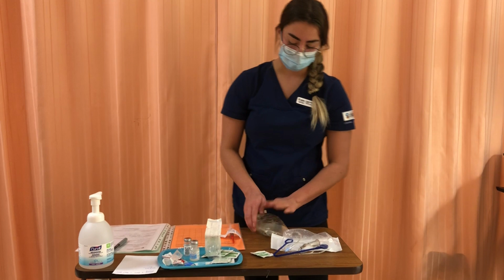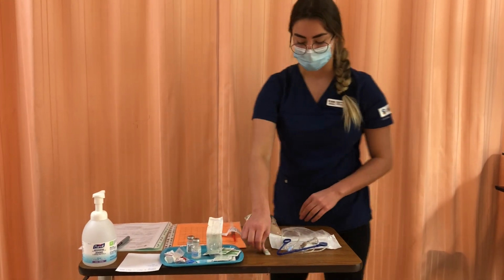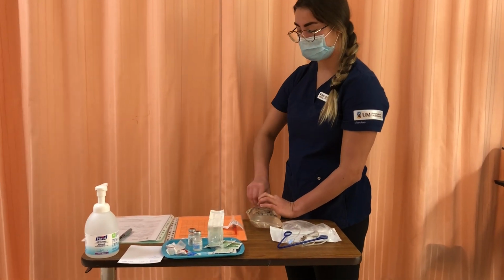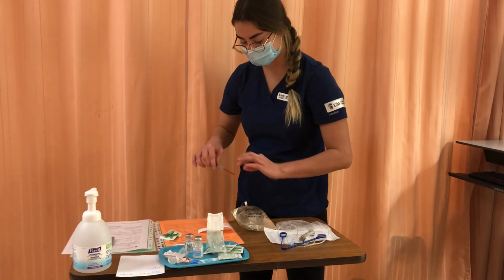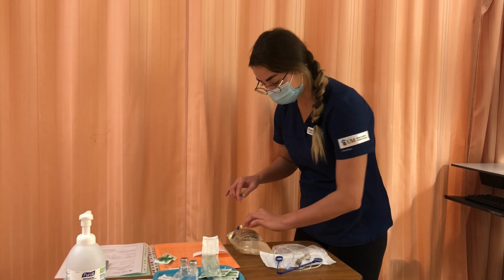So I have my mini bag, I've already checked the integrity of it and the expiry date. So I'll swab for 30 seconds. Let it dry for 15, and ensuring that it doesn't touch anything, I'll inject my medication into it.